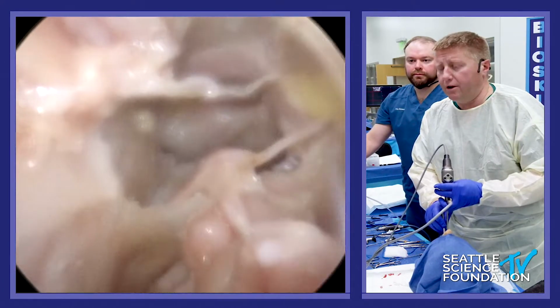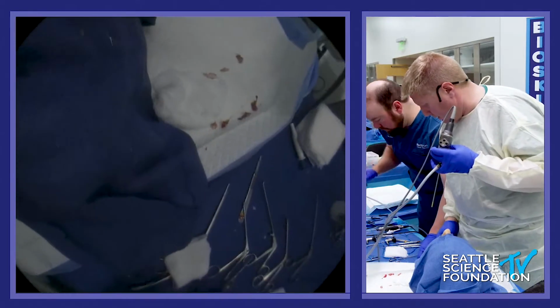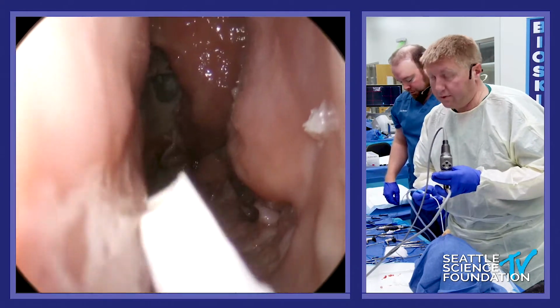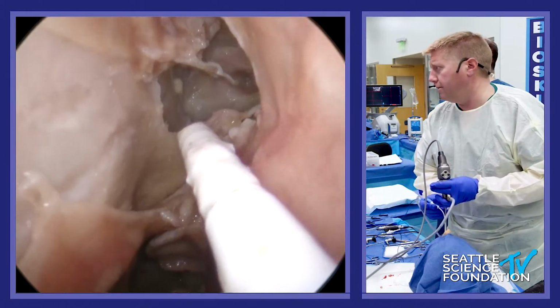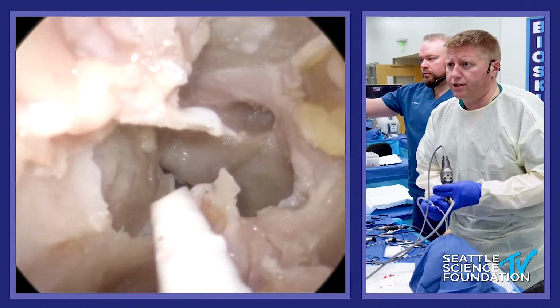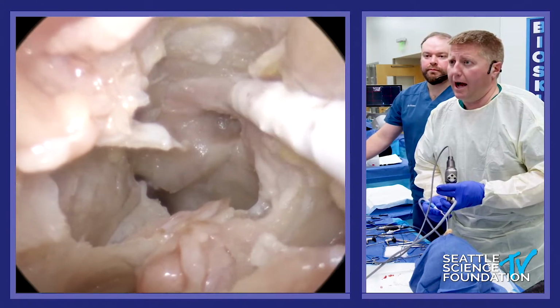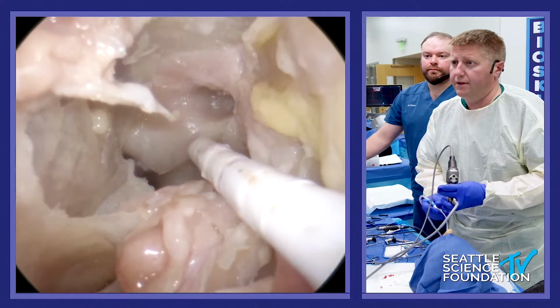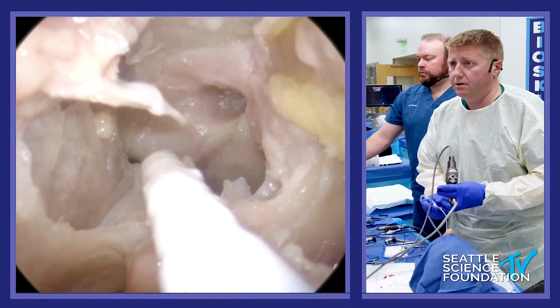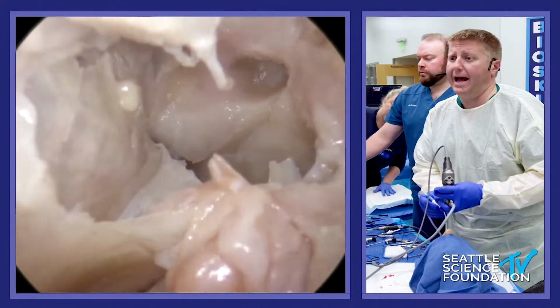So at this point, we want to get good access to the sella and the image guidance section. And could we put the image guidance view up? The coronal would work. Sagittal would be fine as well. So we're in the sphenoid here. We saw earlier an optic nerve decompression. This is your carotid artery. This is your opticocarotid recess. So right here, that's your sella. So we need to get good access to that.